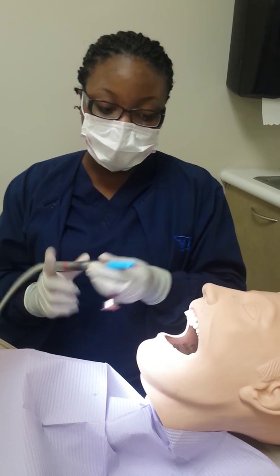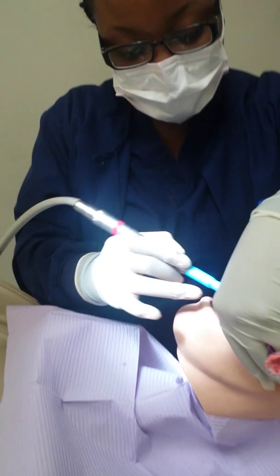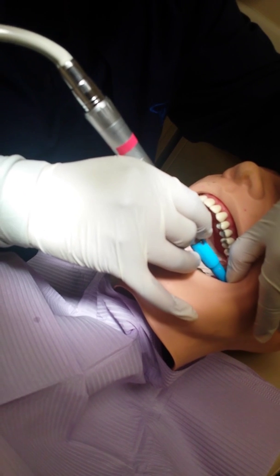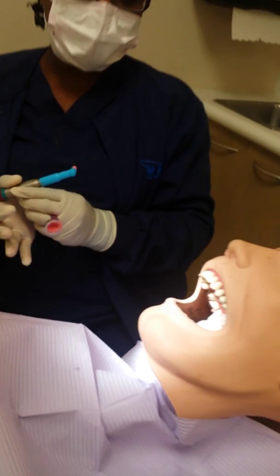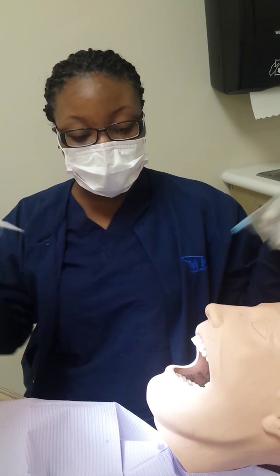Then you would start on the mandibular, just start on this side and work your way around to 32. Then you would come back on the mandibular right side on the lingual side, and you would do the same thing for both sides, and rinse again.